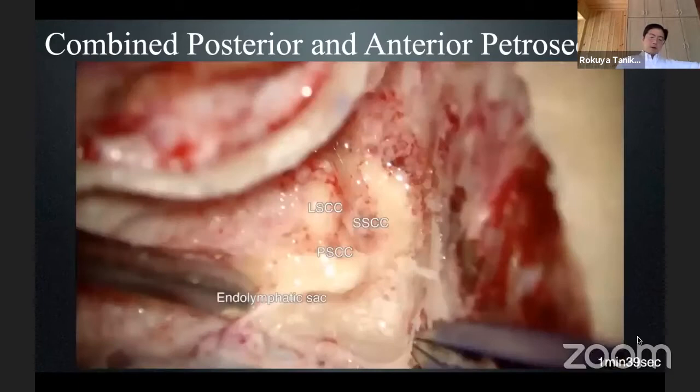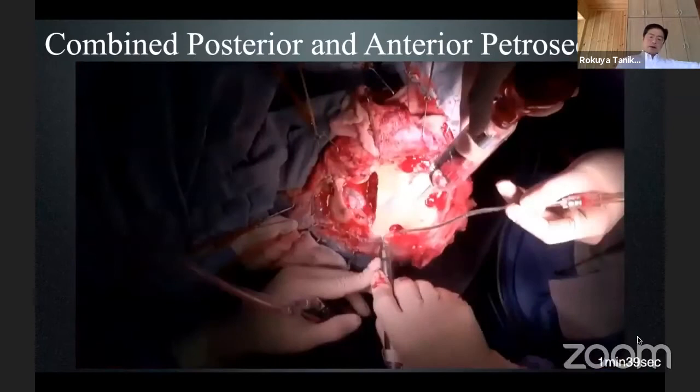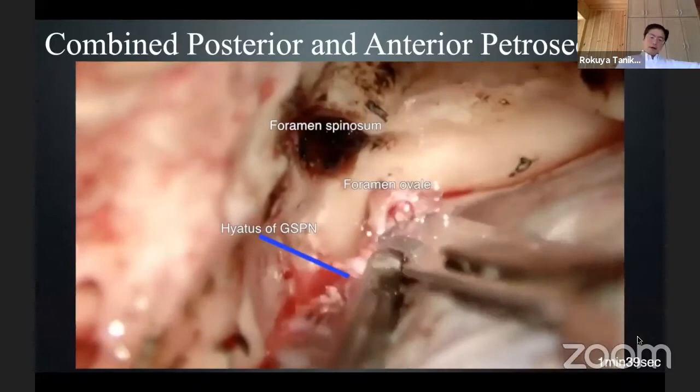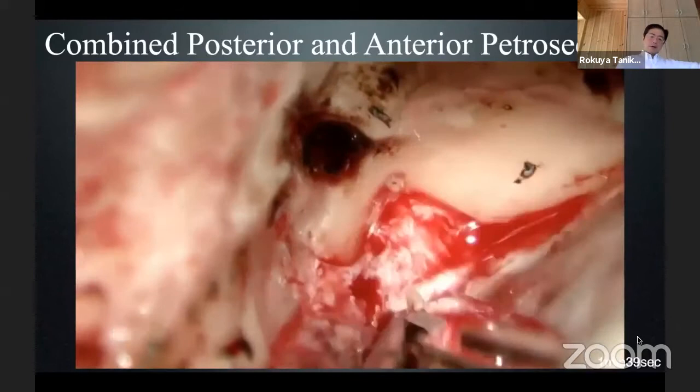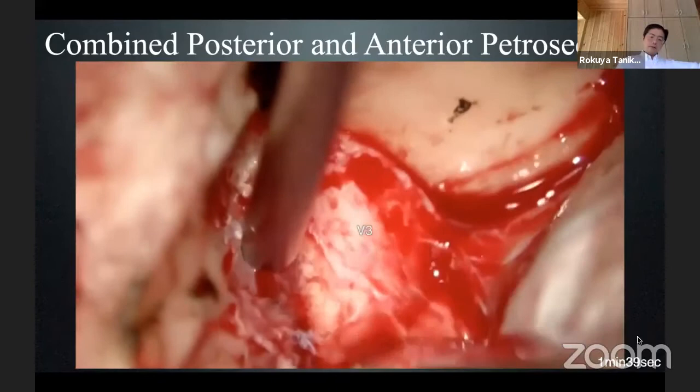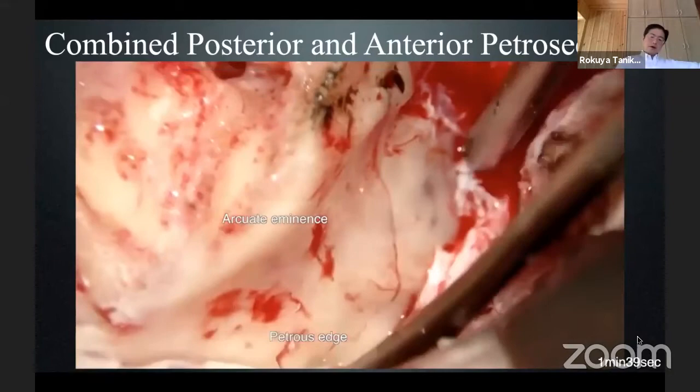The lateral and posterior semicircular canals are exposed, and the posterior endolymphatic sac is exposed. At this moment, a craniotomy is added. This is a subtemporal approach to the middle fossa. This is the petrous apex, and the GSPN is dissected. You can see venous oozing from the cavernous sinus — this bleeding must be completely stopped.